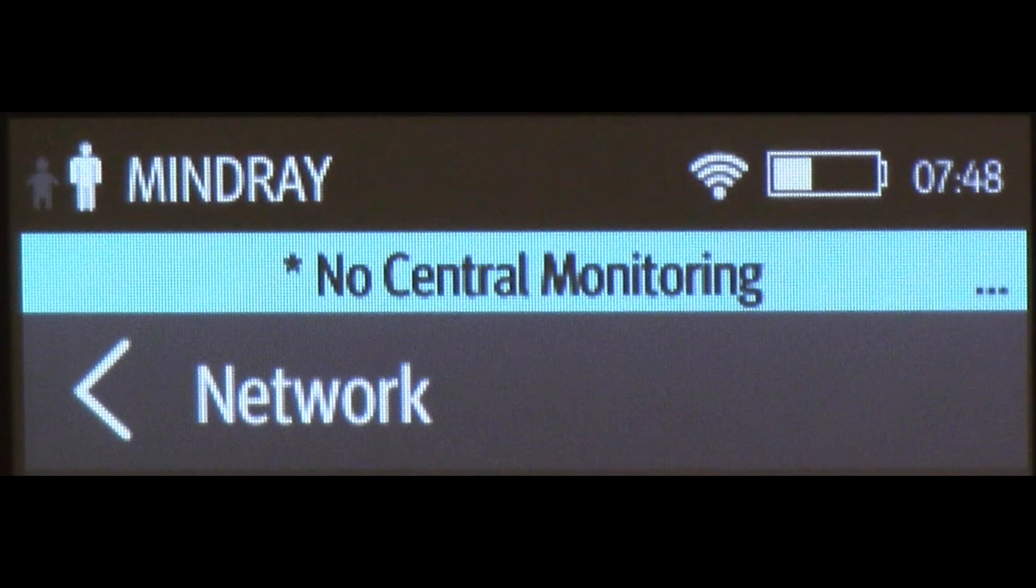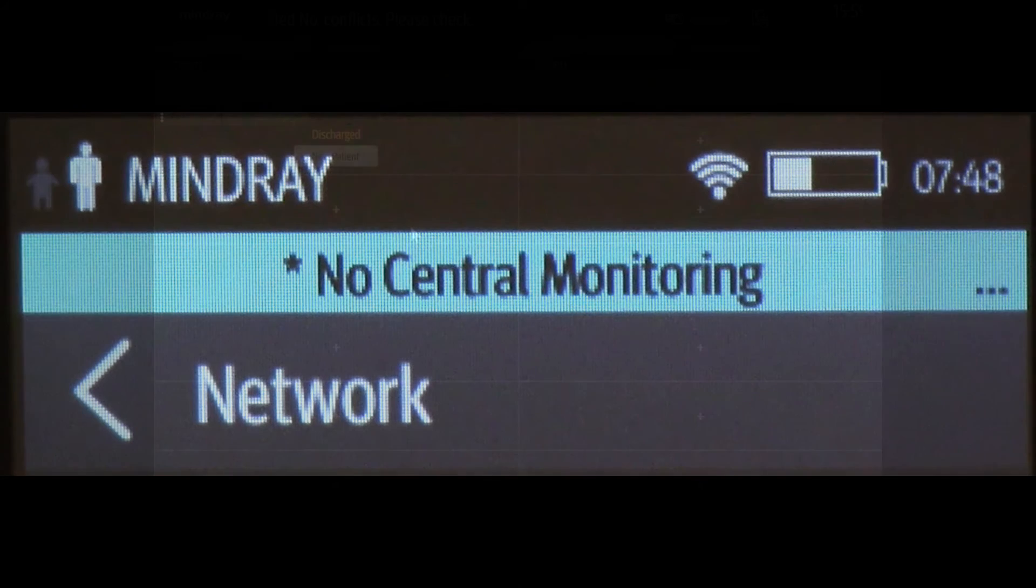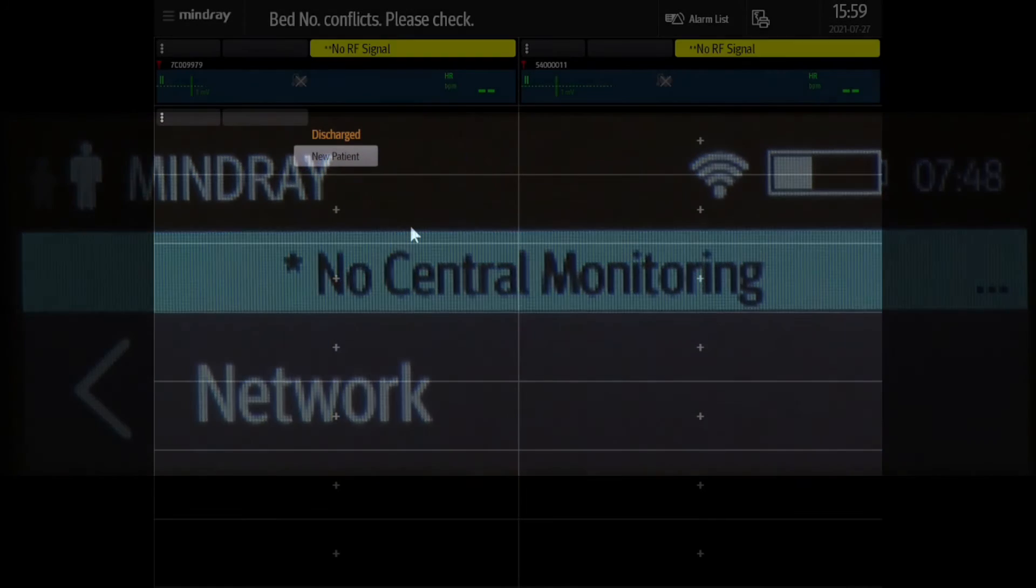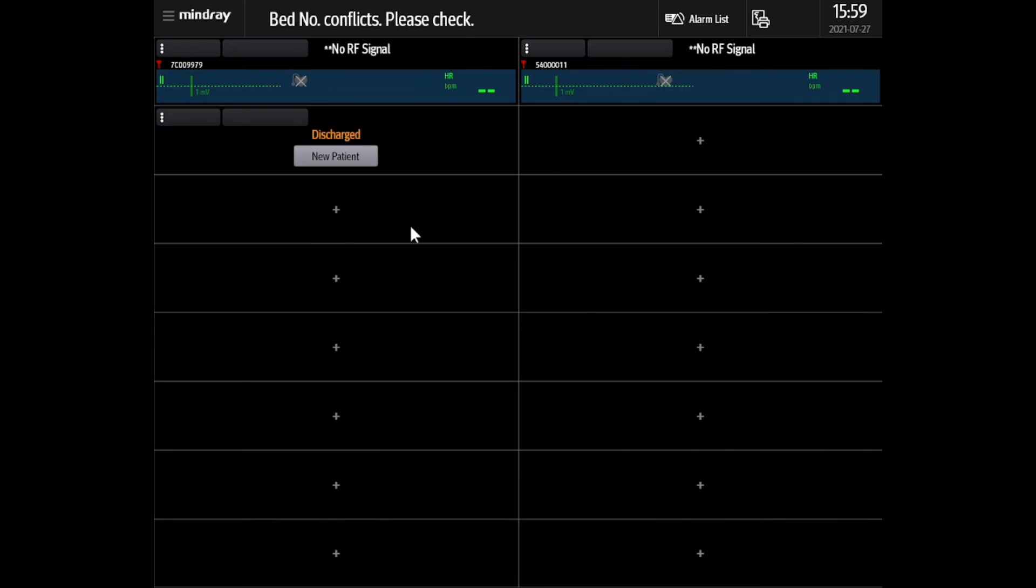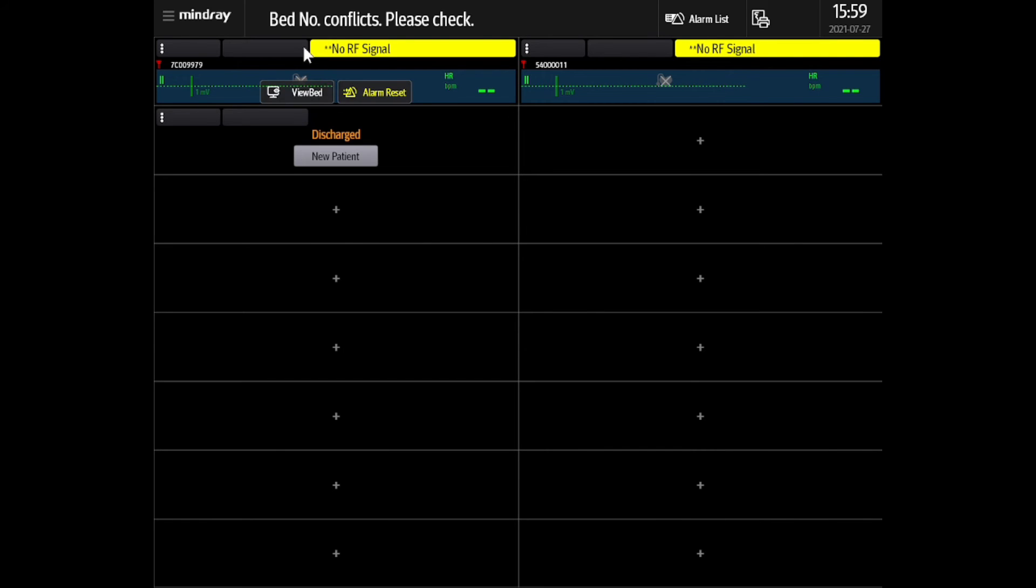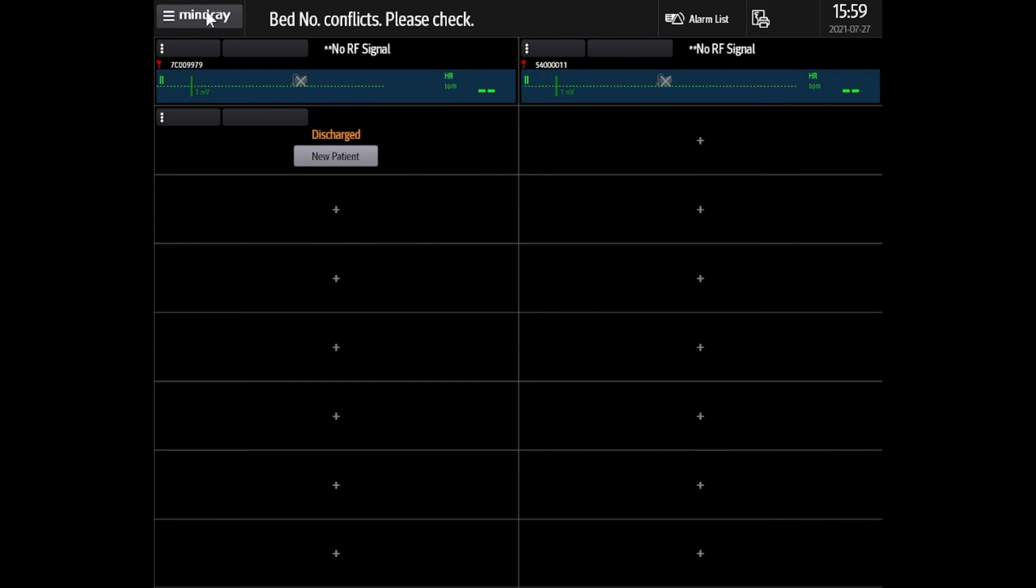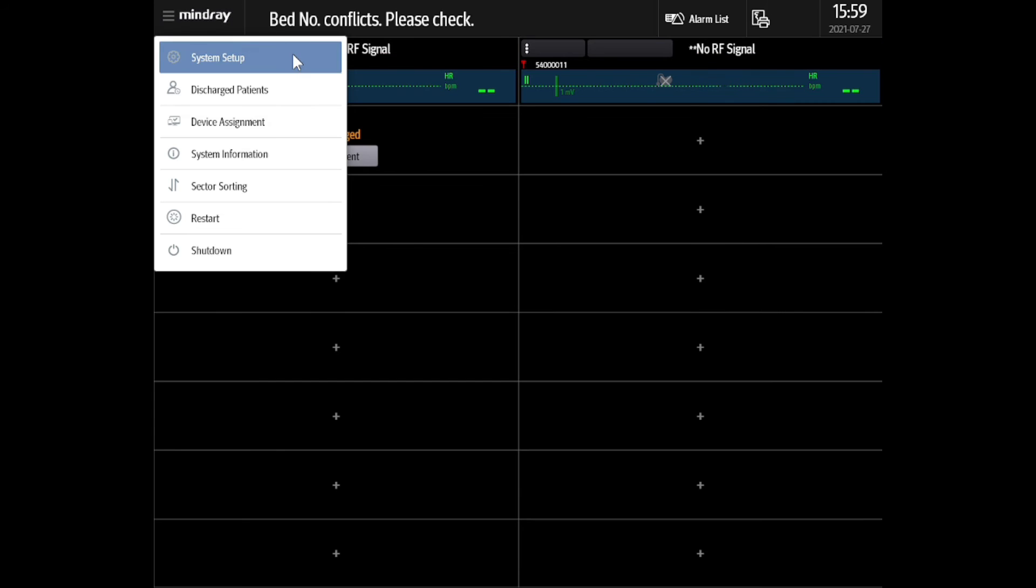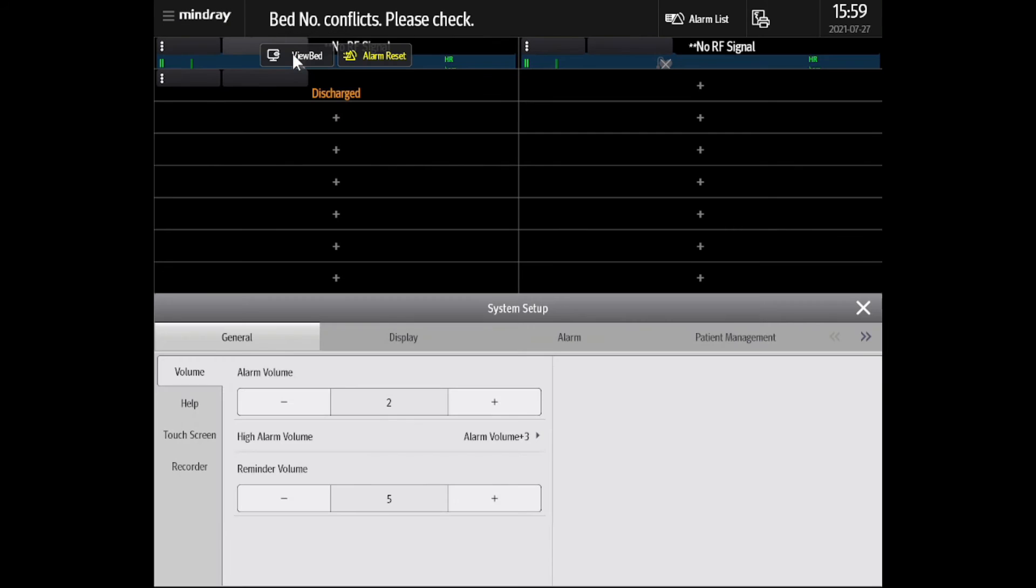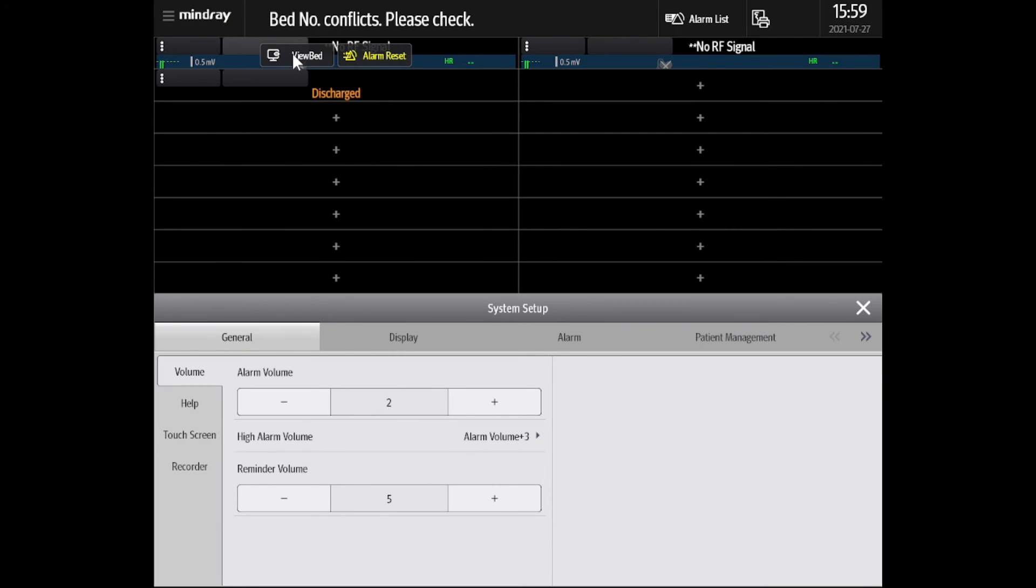Once you've confirmed all network settings and have a good Wi-Fi signal, we will now admit the new TM80. The following will take place in Benevision's graphic user interface. In Benevision, select the Mindray dropdown menu located in the top left corner of the screen. Select System Setup and use the arrows to navigate and find the Device Management tab.